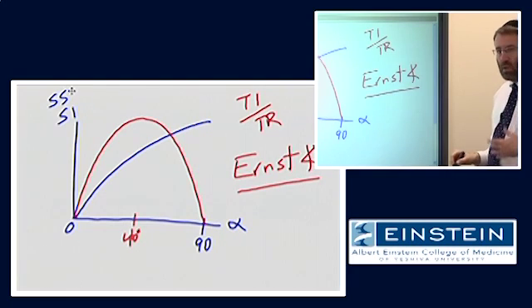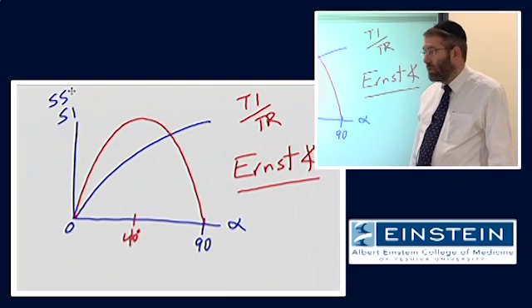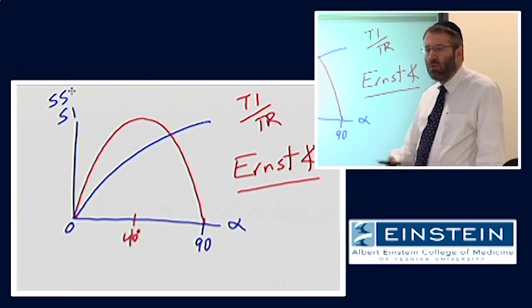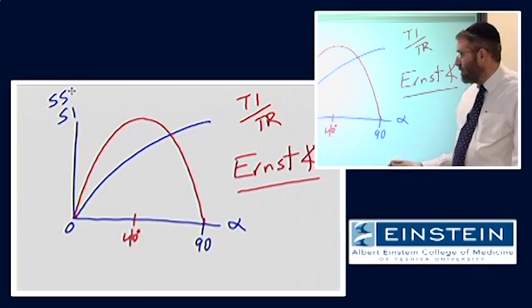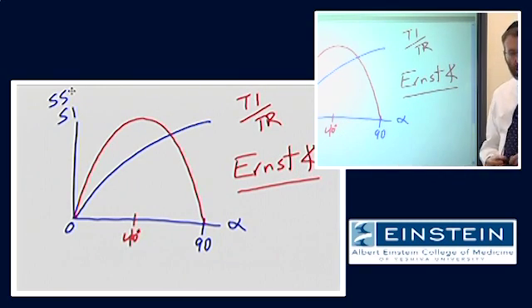Right. So in responding to that question, well, when we do gradient echo imaging, isn't the flip angle going to be different? Well, at least one of the reasons why we might choose a specific flip angle at this point has to do with maximizing steady state signal. And since the T1 of the tissue is not something that we can control, it is what it is, that decision would be based on the TR that we're going to use to image. And in fact, we can compute, right, based on a certain TR, what would be the optimal flip angle. Unless the TR is extremely long, 90 degrees is not going to be optimal.